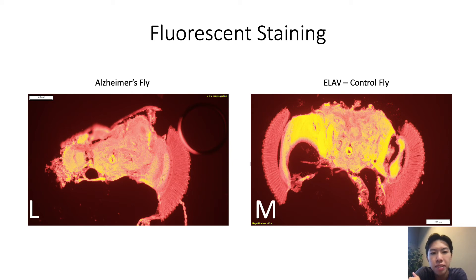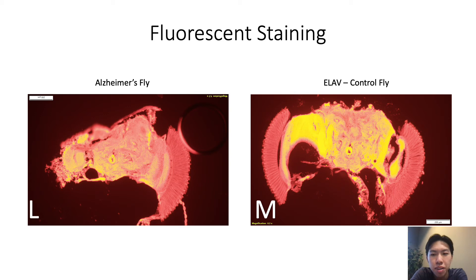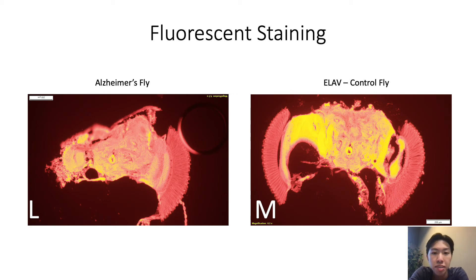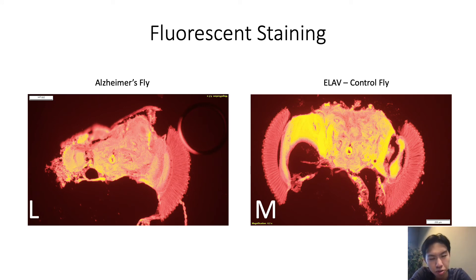These are the fluorescent stains that I mentioned before. We use these to try another visualization because H&E staining is not as sensitive to the signals that we're looking for. The primary antibody in these is the same, but the secondary antibody is directly conjugated to fluorescent molecule CY3. These are just some preliminary results. I believe these slides aren't really representative of our findings due to the possibility that the camera exposure may have changed between slides, so I won't draw conclusions from these until I can complete more reliable and precise imaging. But you can already see that the fluorescence allows you to distinguish signals a lot easier compared to H&E or regular primary antibody staining.